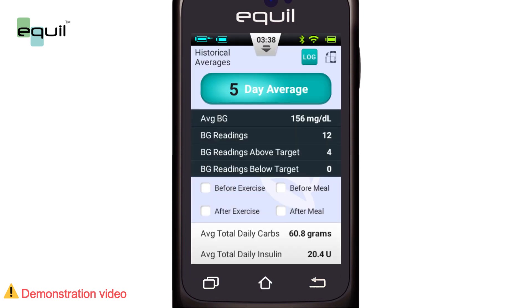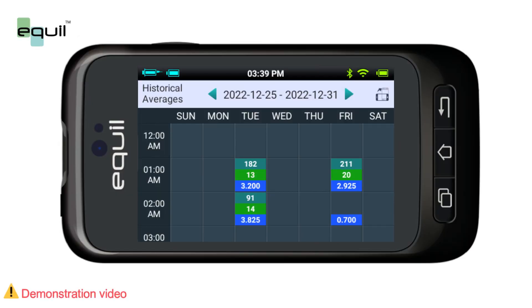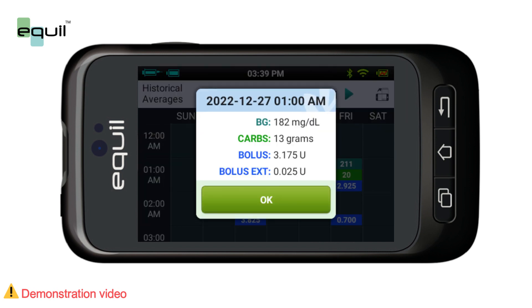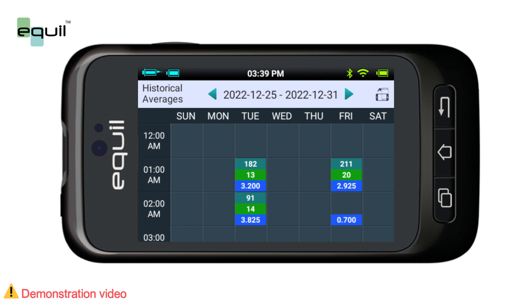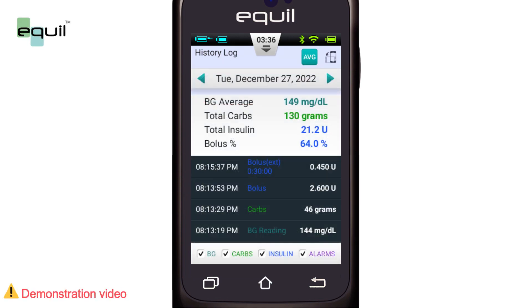At the bottom of the screen, you can choose different filters to show, for example, the averages of all readings taken before or after exercise, or before or after a meal. While viewing historical averages, we can access calendar mode by rotating the PDA to landscape orientation. The left side of the screen shows the time, while the top shows the day. When you tap on any hourly data, detailed information is displayed. We can also change the week using the left and right arrows, and by clicking the Log button, you can return to the daily log.